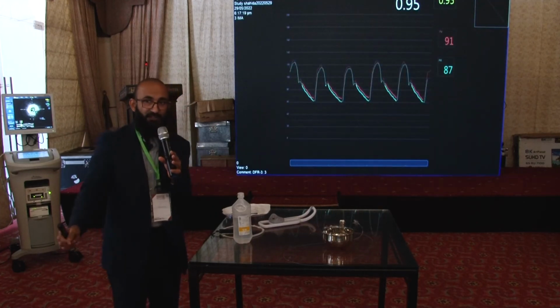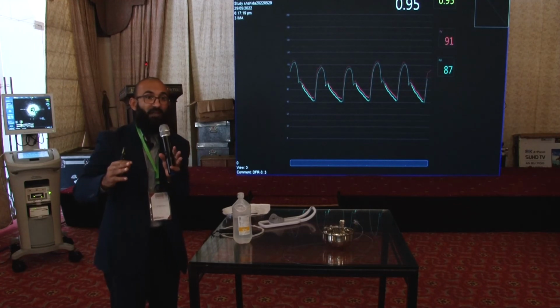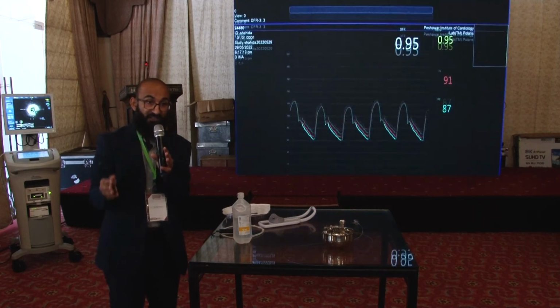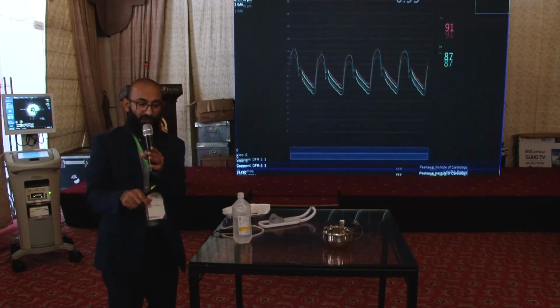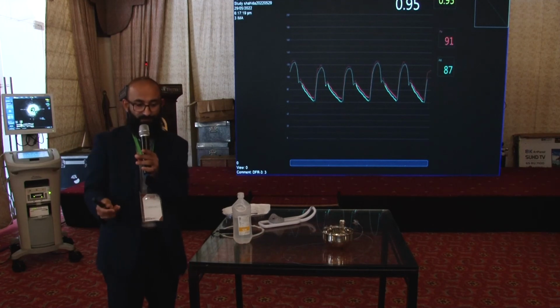You put a stent in, you do a post-stent run, and you see the stent expansion. You can make sure there is no edge dissection, proximal and distal, and that your stent is well expanded and well apposed. In a similar fashion, we have data about physiology post-PCI. If your iFR is more than 0.95, your event risks are very low, both short-term and long-term.